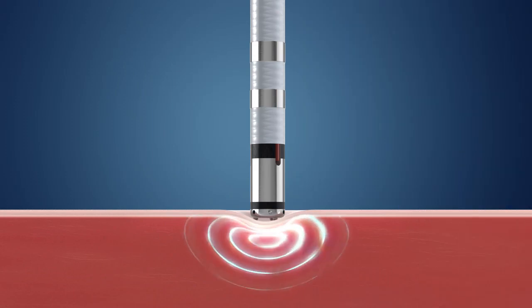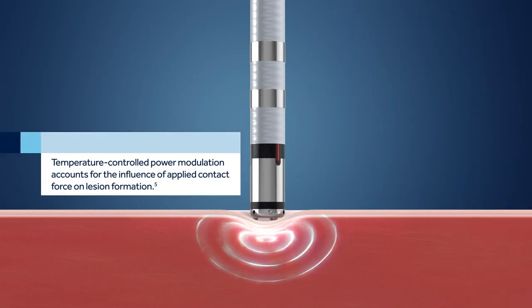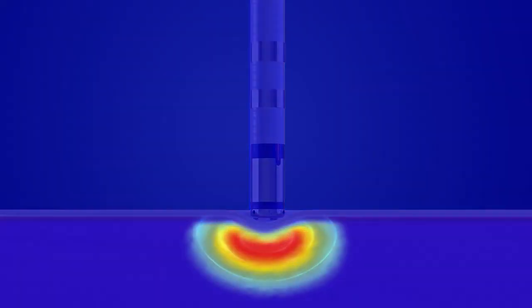Tissue surface temperature can serve as an indicator of tissue contact. While ablating with no or poor tissue contact, temperature may not rise to the target temperature. With firm tissue contact, the system will modulate power once the target temperature is achieved.